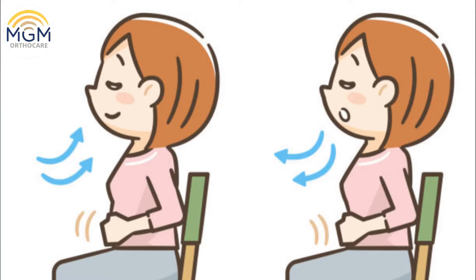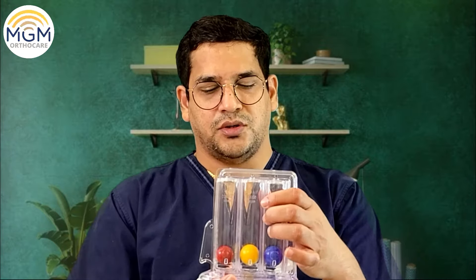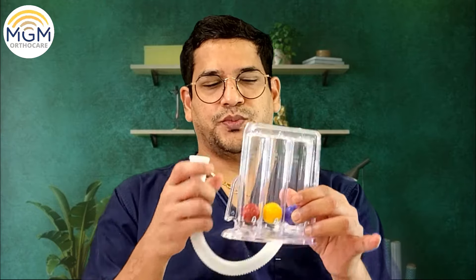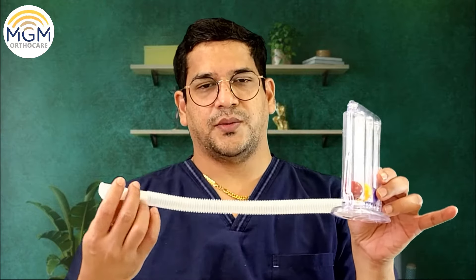It's a very simple exercise that can be done at home. This is a spirometer which is available in the market. It has got three balls — blue, yellow, and red. Just keep it in this way. This is a mouthpiece and this is an air pipe.